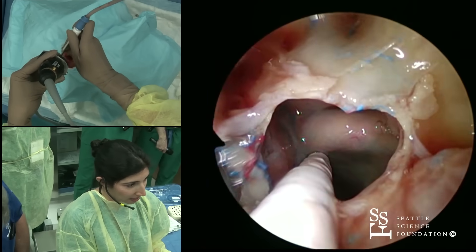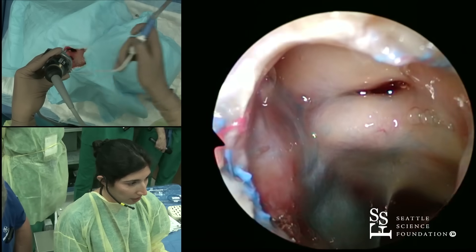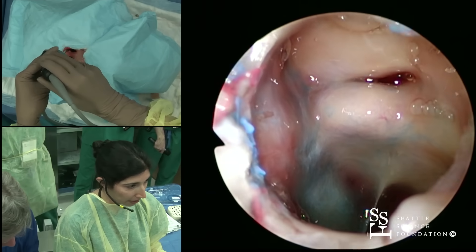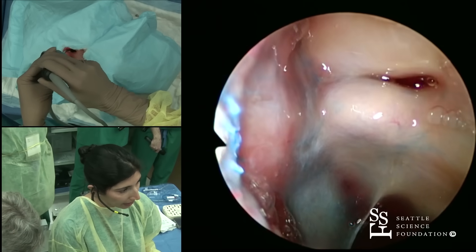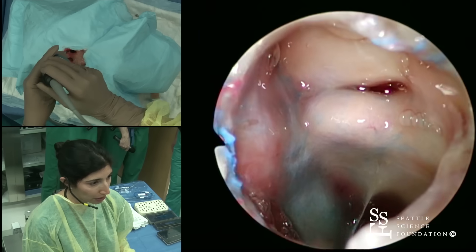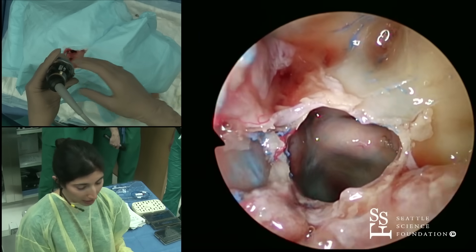Here within our sphenoid sinus, you have really good anatomy that you can see. Looking over immediately, that's the intersinus septum. You can see a really good bulge posteriorly here, and we're going to open this up a little bit more.